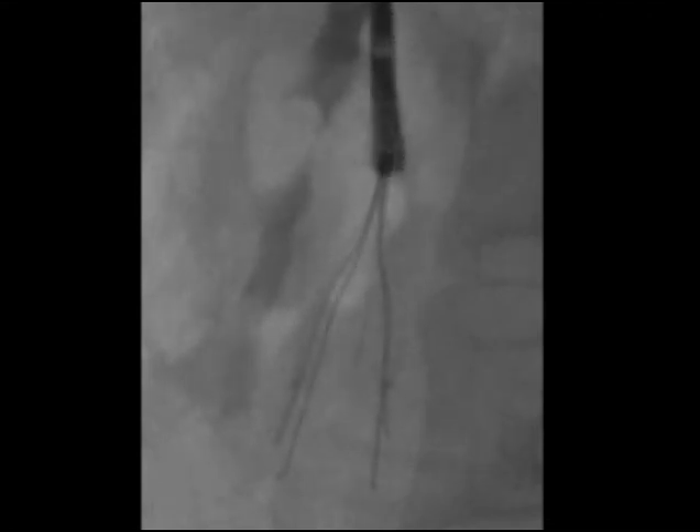In this example with a different filter design, note that the sheath itself is sometimes used to aid in the dissection. Once again, once the filter is captured, the operator needs to ensure that it is not protruding from the side of the jaws, which will prevent retraction into the sheath.